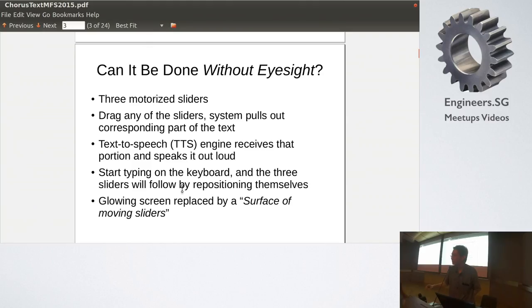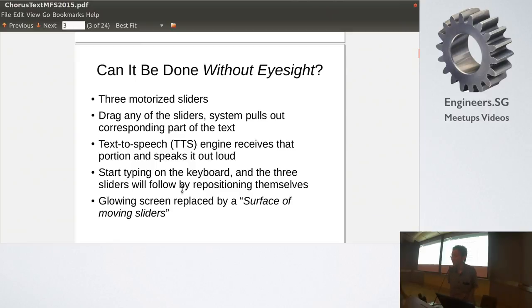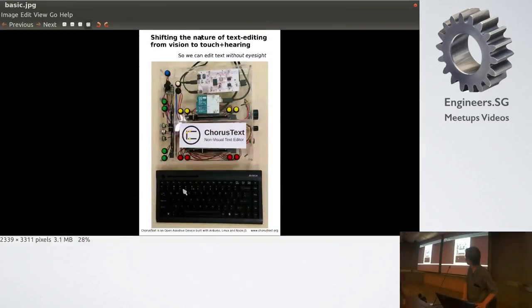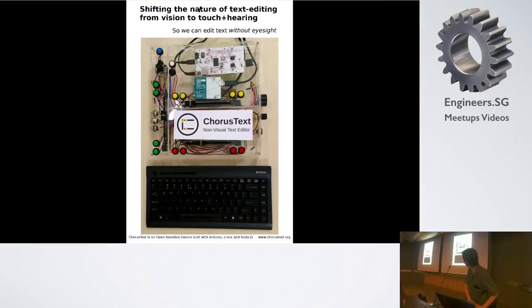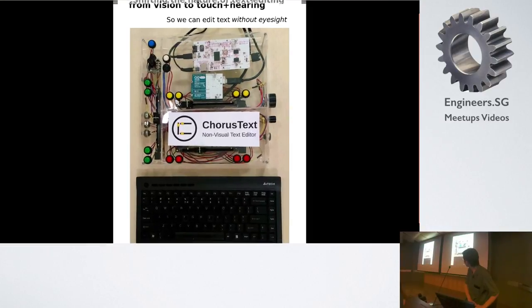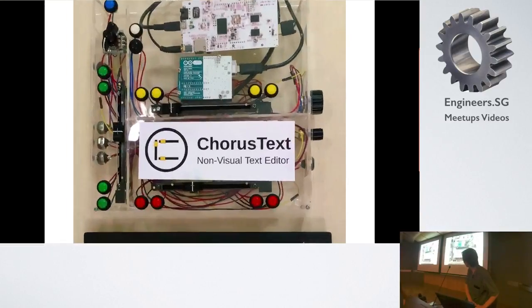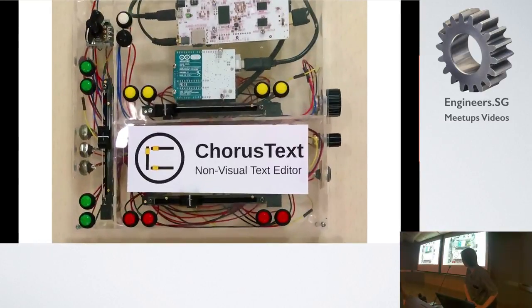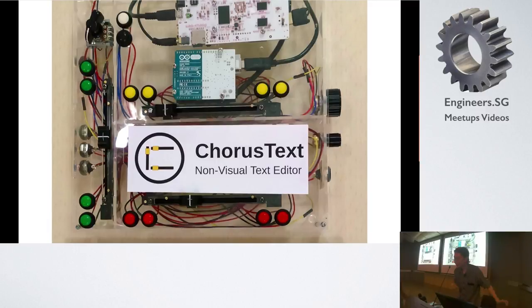The system keeps track of the position of the slider and then pulls out the corresponding part of the text and pass it to text-to-speech. So it looks a little bit something like this. Yeah, so I zoomed in on the device there.